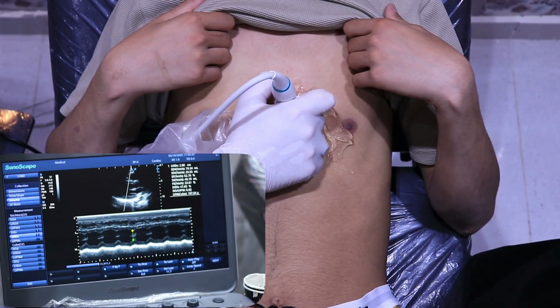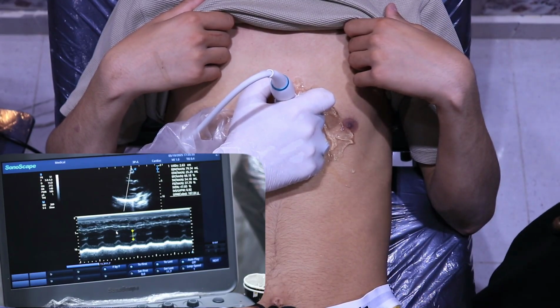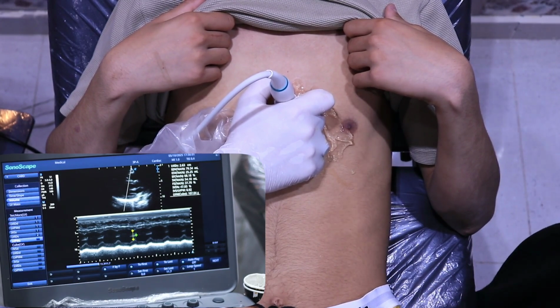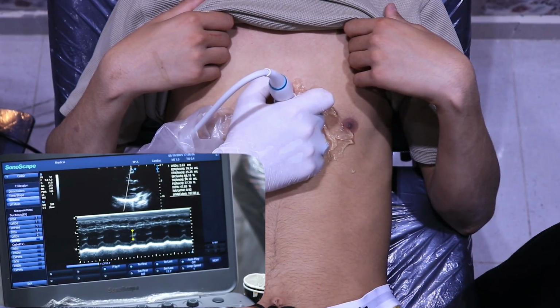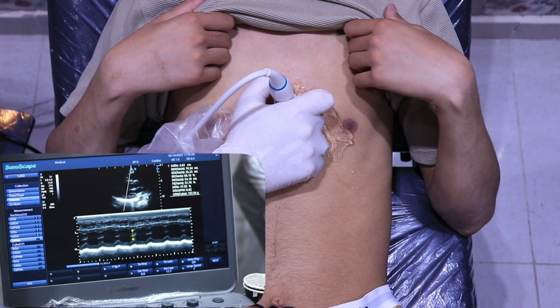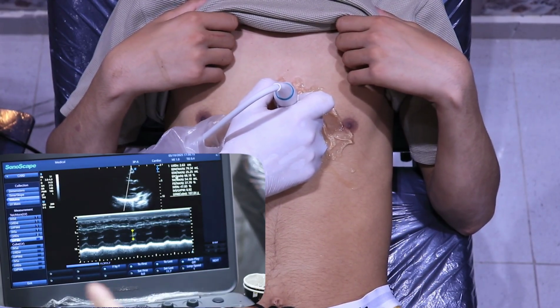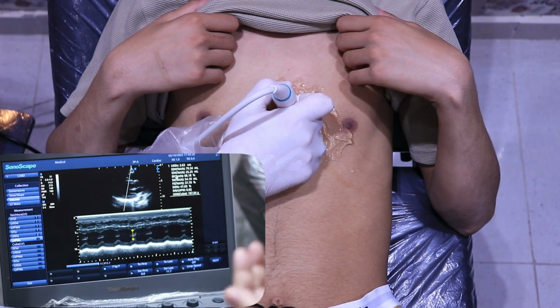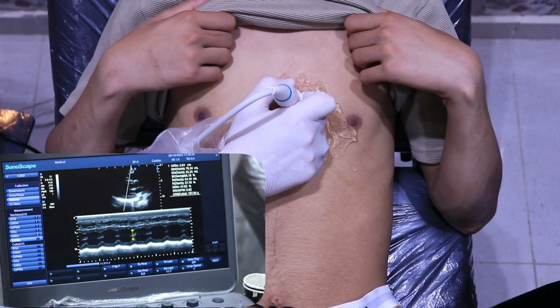الايكو هي داون الايكو هي اكتر. Exactly. السيستولي is from البوينتر from this cursor here to here. This is the systole. So we'll go back to calculation, and this is the systole. And this actually calculated the ejection fraction to be how much? 68%. احنا عندنا ال diameter during diastole and the diameter during systole. هنعمل ايه؟ هنضرب الدايستولي 3 مرات في بعض ونطرحه من السيستولي 3 مرات في بعض ونقسمه على الكيوب اوف diastole يدينا ejection fraction. هو هنا الماشين اوتوماتيكلي بتعملها.